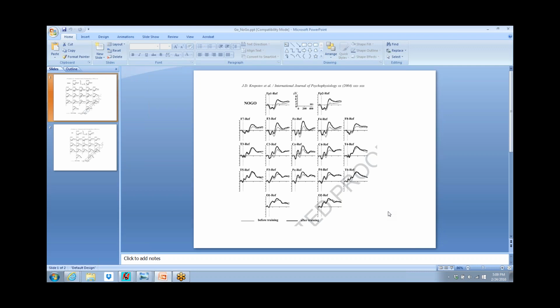Two kinds of visual stimuli: animals and plants. So it can be given to any age. You don't have to be verbal, you just have to be visual. And they're not tricked. It's not like a green animal standing there like a plant or something. These are distinctly animals and plants, and they're black and white. It's easy to identify which is which. If the first stimulus is an animal, you may have to respond to the next stimulus. If the first stimulus is a plant, you will not respond to the next stimulus. So it's a primed stimulus with a warning as to whether you have to respond or not. If the second stimulus is an animal, you hit the button.